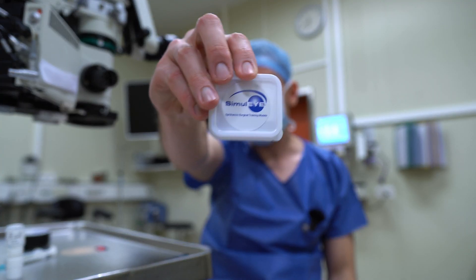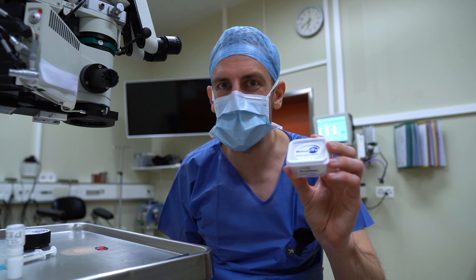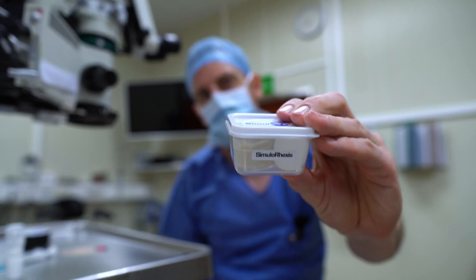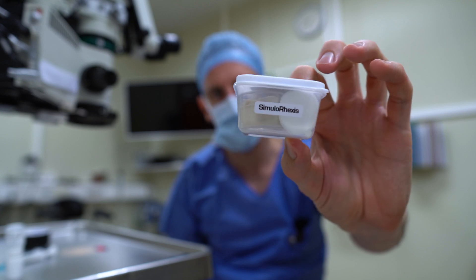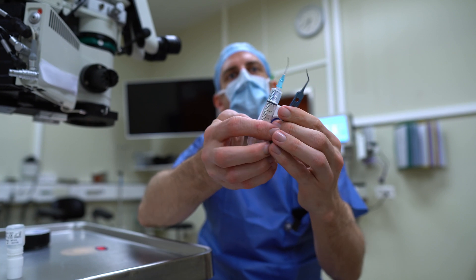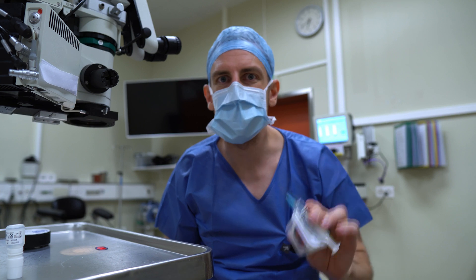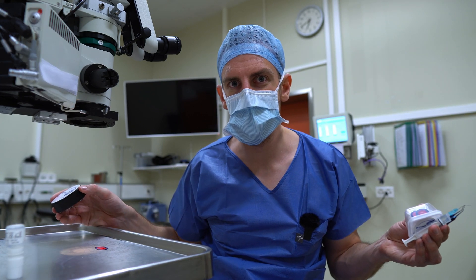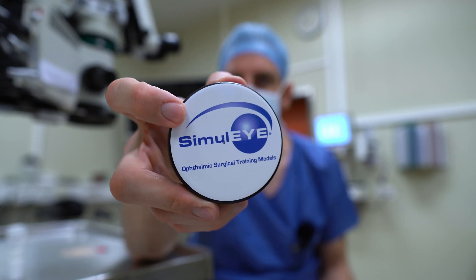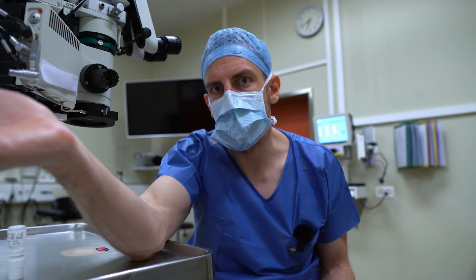So what do I think of the Simuli Simulorexis Eye? I have to say I am very excited about this — it is very, very good. First of all, check out the size. It is so small; this is the whole thing. You need a forceps and some viscoelastic and that's all you need. You can just stick this eye to your table and you're good to go. If you want to be a little more comfortable, get this little eye holder — it has a nice Simuli sticker on it and some rubberized feet, but it's basically just a repurposed hockey puck.